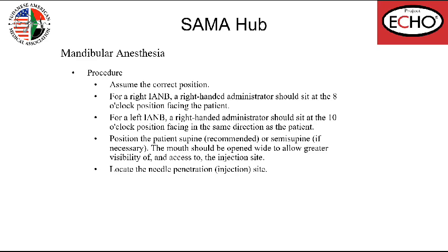After having the correct position, then position the patient in a supine position or semi-supine position. The mouth should be opened wide to allow greater visibility of and access to the injection site.